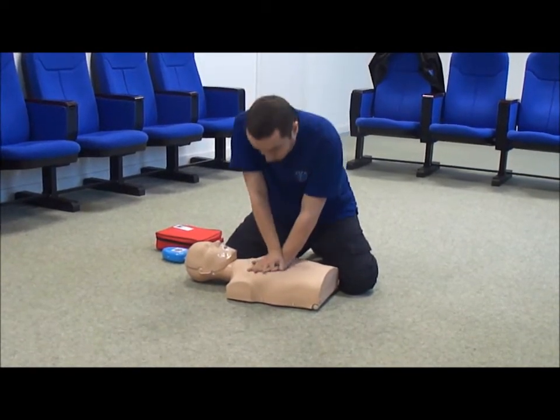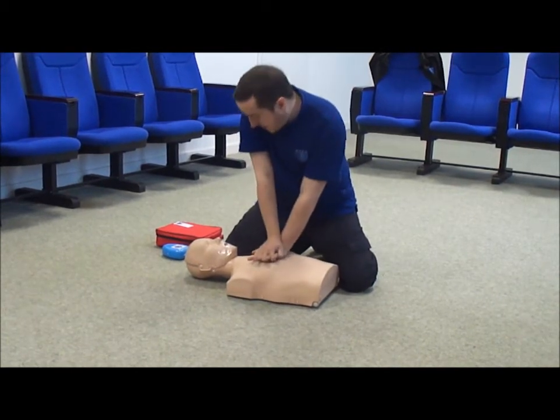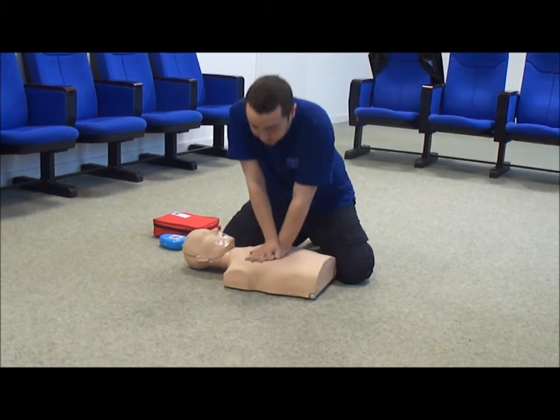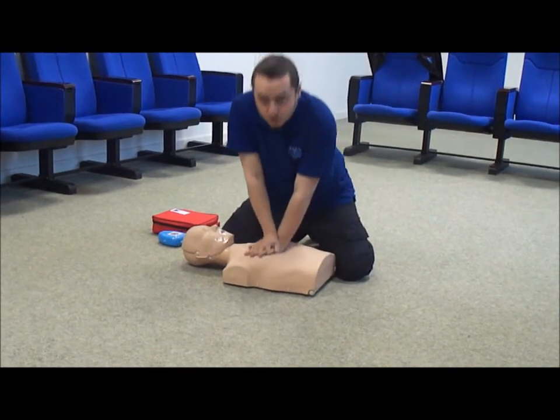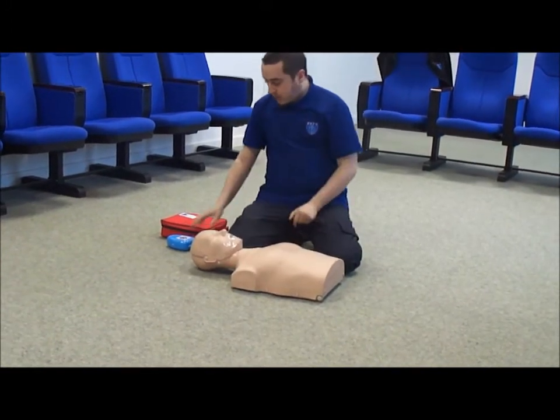So we begin. 1, 2, 3, 4, 5, 6, 7, 8, 9, 10... 28, 29, 30. So I've given my 30 chest compressions.